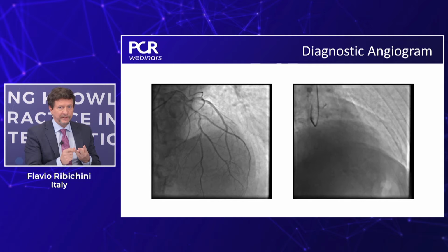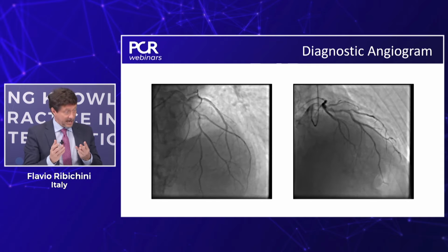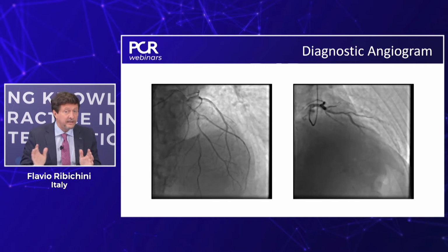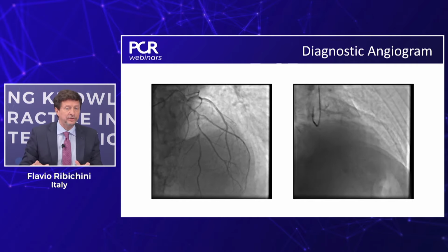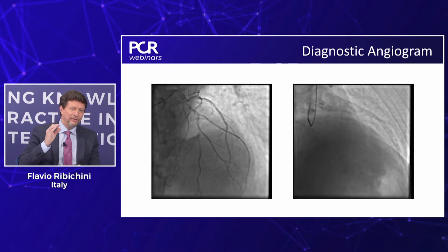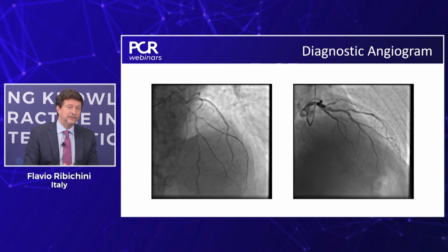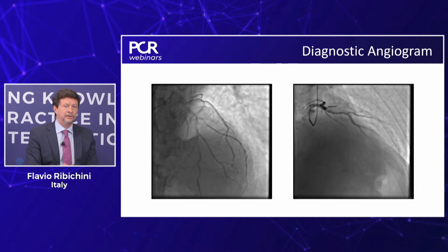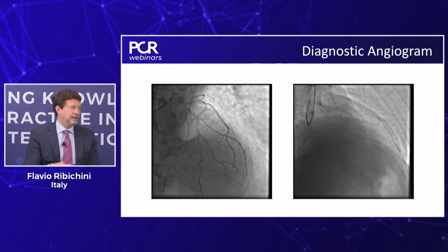You did a non-invasive CT showing that there is calcium, so the likelihood of having angina as a symptom is getting bigger, but we still have what I consider a rather benign or intermediate lesion. I don't see this as a focal, using a very old terminology, critical stenosis on the LAD. I'd like to know if you are convinced that this LAD, provided that the right and the circ are okay, is the cause of these symptoms, and these symptoms are really typical ischemic angina.